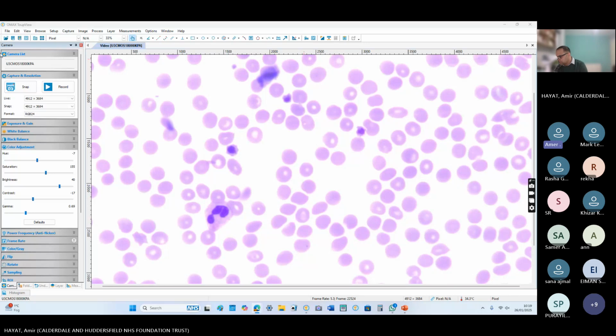What investigations would you like to do? First, there can be light transmission aggregometry, flow cytometry, and genetic studies, and ristocetin. For von Willebrand type 2B, ristocetin platelet aggregation. For storage, we will do the ATP/ADP ratio. So a ristocetin screen, peripheral blood flow cytometry, and light transmission aggregometry.